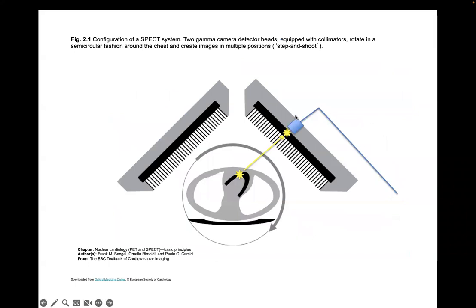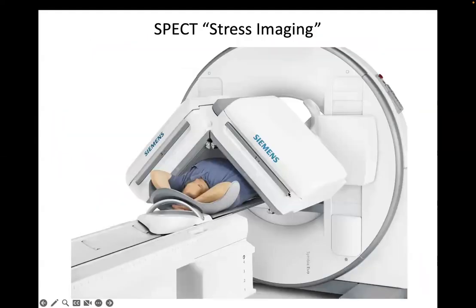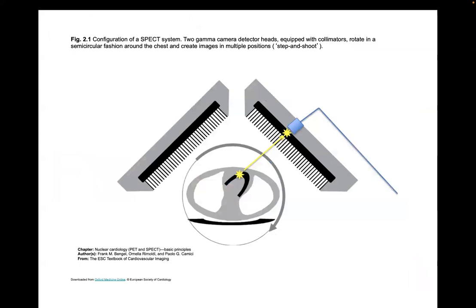And the basic location of that thing is you have the sodium iodide crystal here, and then this would be the photomultiplier tube, and then a pulse would come out of here when an event occurs, and you have a set of these lined up along here. They're all about 1 inch in diameter, so you can imagine something that's 50 centimeters around, because we saw, here's the detector here, right? So it's that size, and you have photomultiplier tubes sort of 1 inch in diameter spread out over this whole thing under here. That's how many you got.